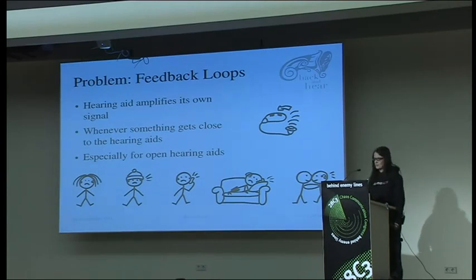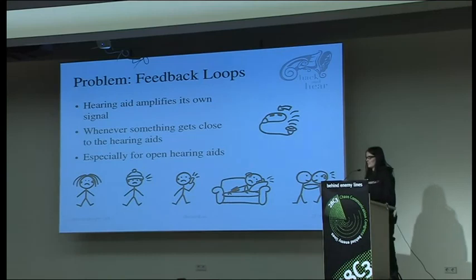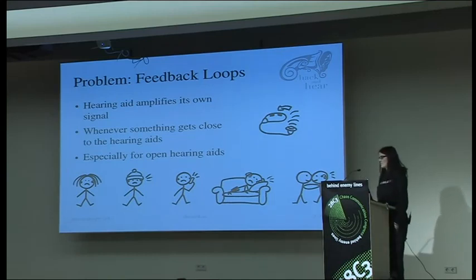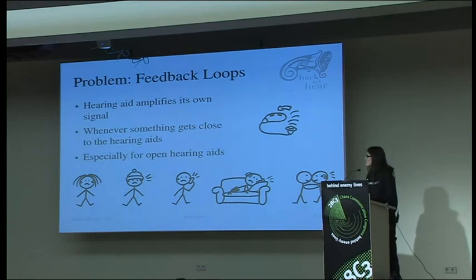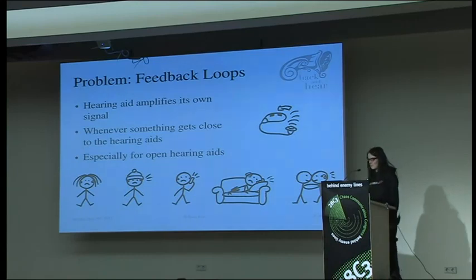A very common problem with hearing aids is feedback loops. Especially if you have open hearing aids, it can happen that the hearing aid captures its own sound and amplifies it a lot. This is the squeaking you get when you get too close to them. And this is really annoying.